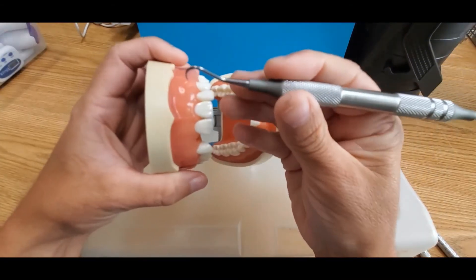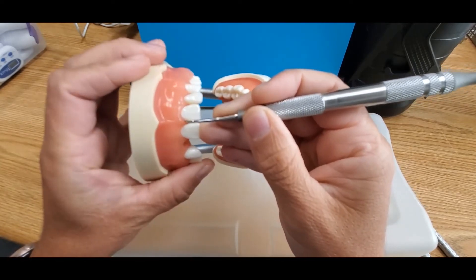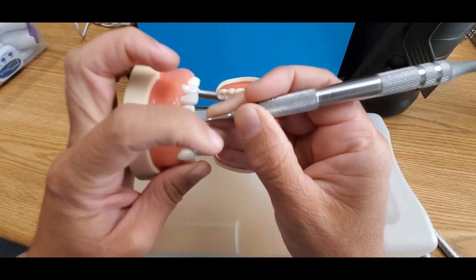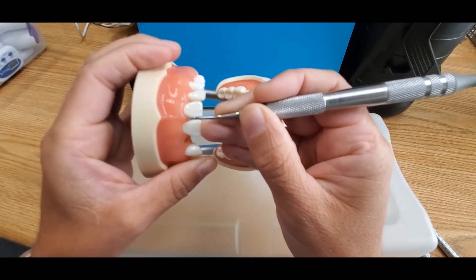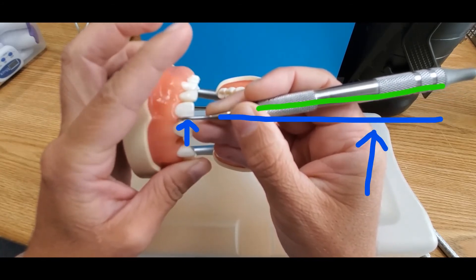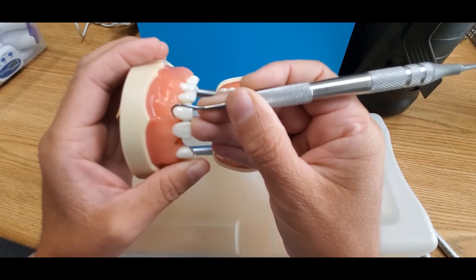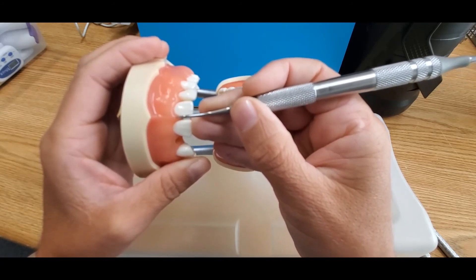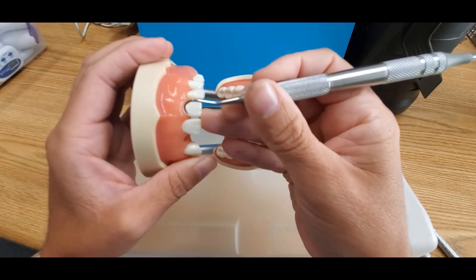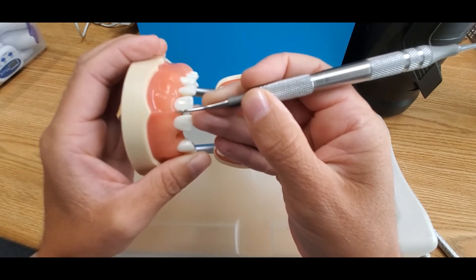The other option for finding the correct working end is to hold the instrument so that the terminal shank is parallel with the long axis of the tooth, and then look to see which way the handle points towards. In this case, holding the instrument between teeth numbers 8 and 9, you can see that the handle is pointing towards the mesial surface, or the towards surface, of tooth number 9. This indicates that this is the correct working end for this area — this end is the 7. Maxillary anterior surfaces towards is the 7.